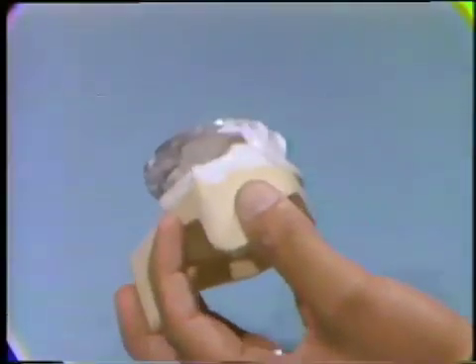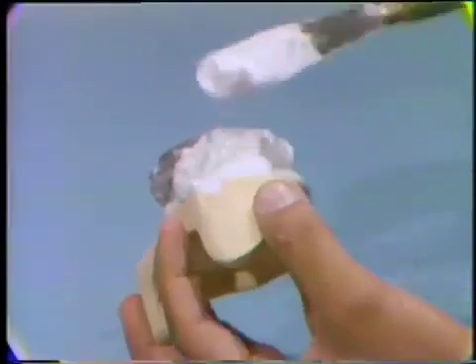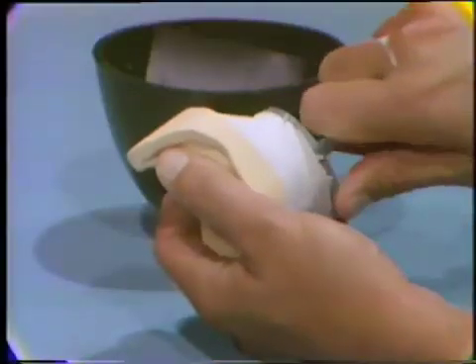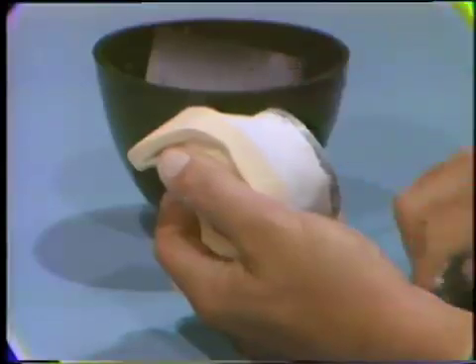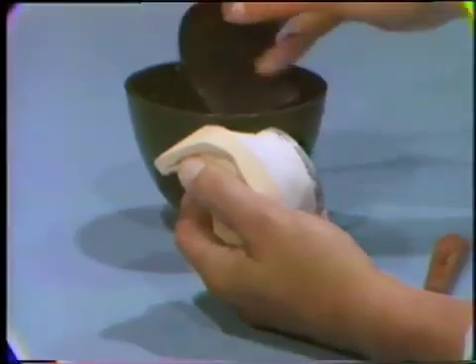Then allow it to set. Using a knife, take away any rough areas in the plaster. Then smooth the plaster with wet-dry carborundum paper.